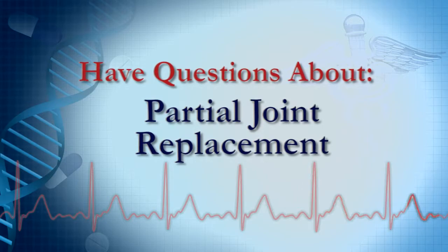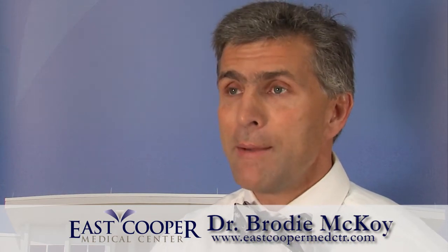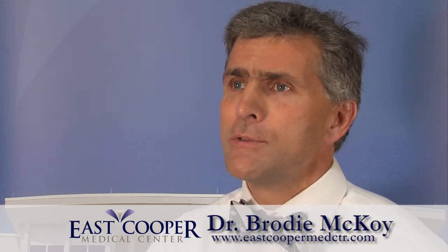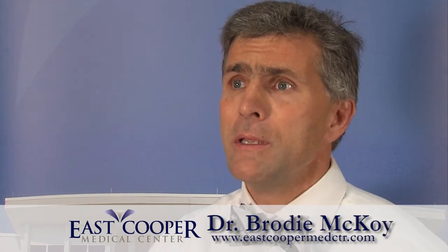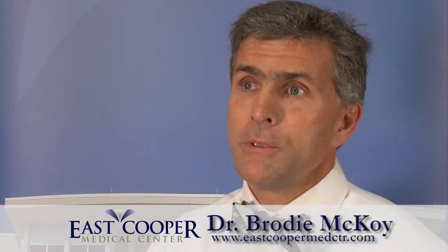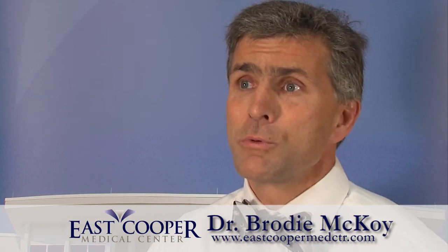The knee is composed of 3 separate compartments. If all 3 compartments of the knee are involved, then a total knee arthroplasty is the only viable option. However, recent studies have shown that 10 to 25% of all people with osteoarthritis of the knee involve only 1 to 2 compartments. When a total knee arthroplasty is performed, all 3 compartments of the entire knee are replaced.